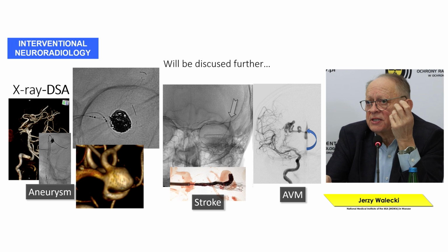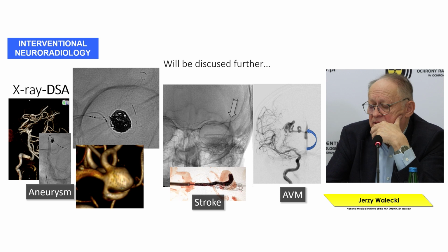These procedures we perform them on an everyday basis, and they are life-saving procedures. We prevent brain strokes. You can see here after the removal.